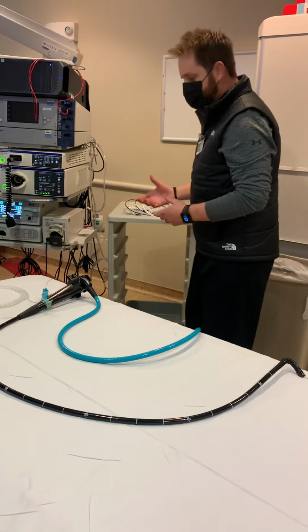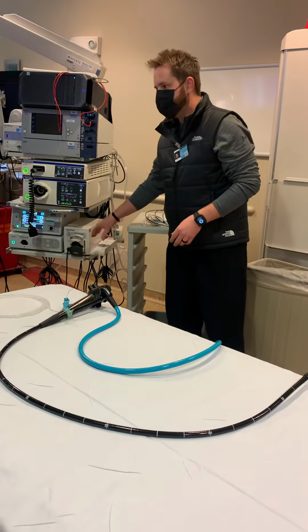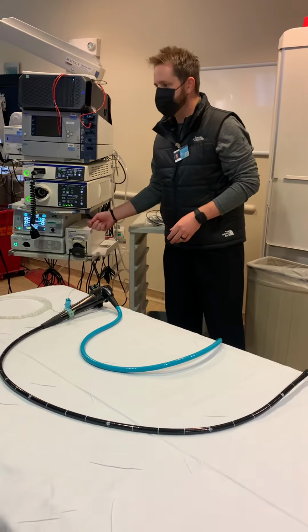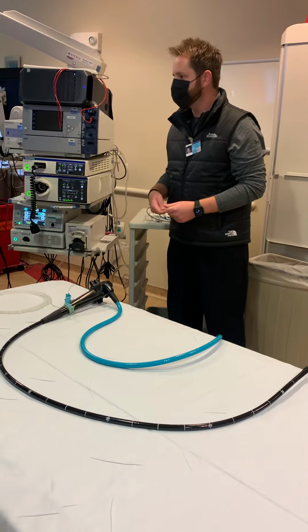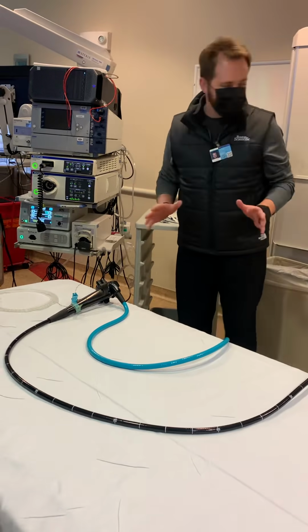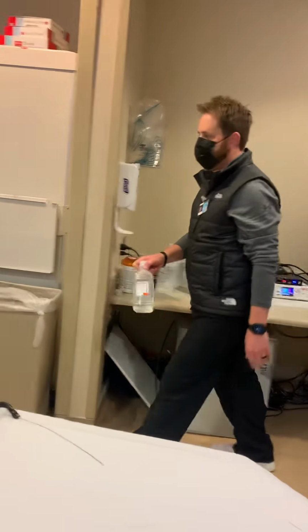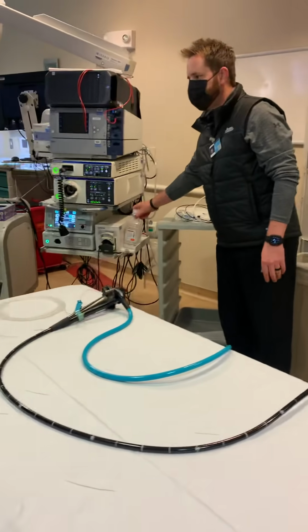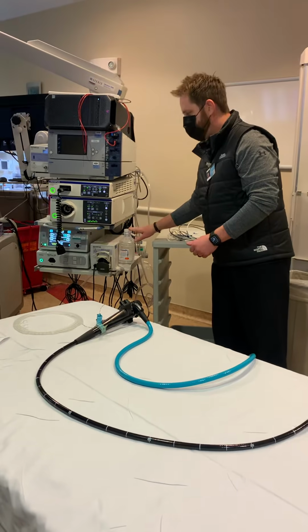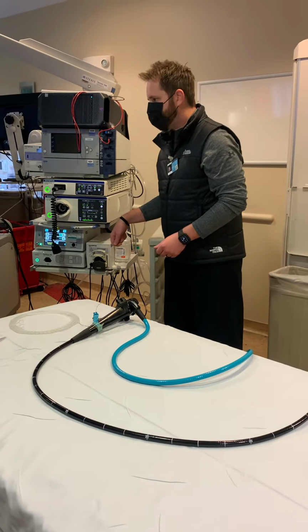Then the other thing this individual can do is, typically you'd have irrigation set up here for your colonoscopes and everything else. That exact same irrigation tubing is going to plug directly into Spyglass. So the easiest thing to do with all Spyglass procedures is to come over here and grab saline and just swap out the bottle. So just take the cap off, drop the same tubing into the saline bottle. The tip of that saline is going to connect in the Spy.